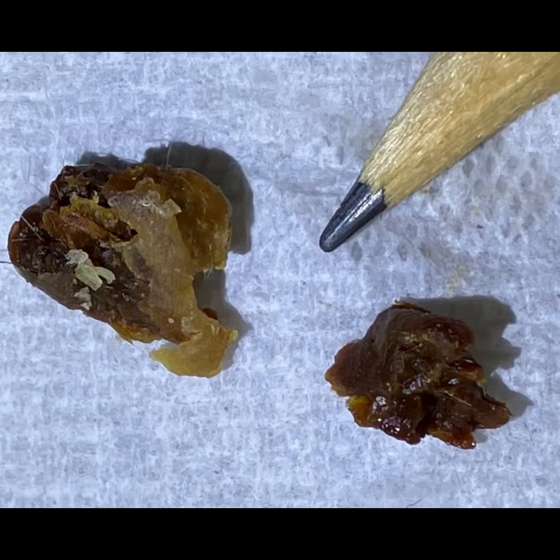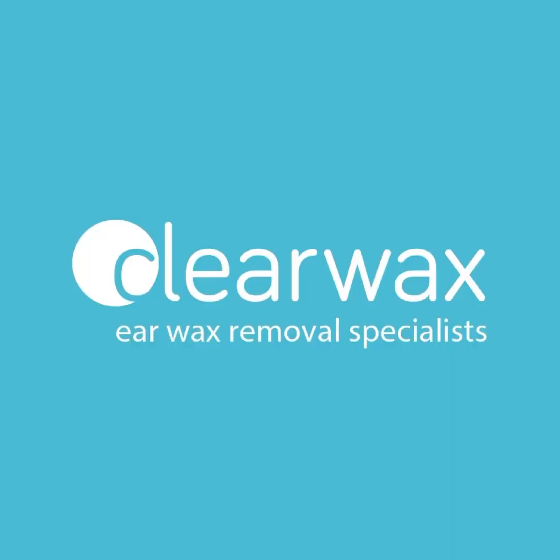The plug to the left was the patient's left ear and to the right is the right ear. There's a pencil there to give you some perspective. I hope you enjoyed that video, and if you are interested in the Waxscope, please do email info@clearwax.co.uk and we'll add you to our mailing list. Thank you, bye.